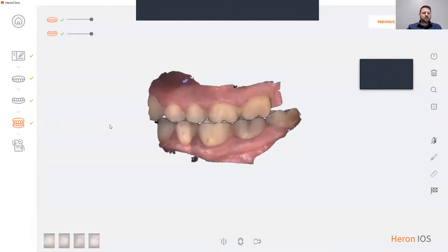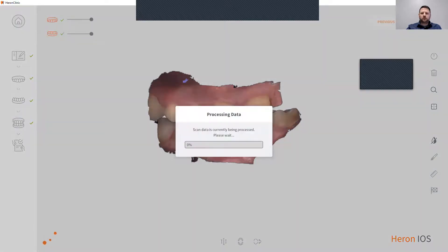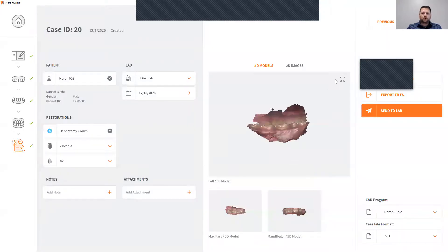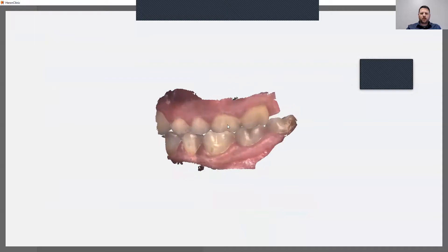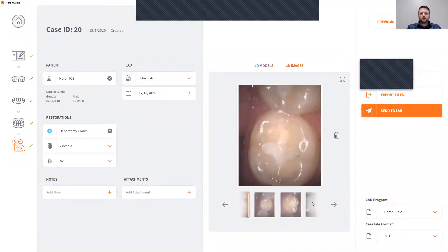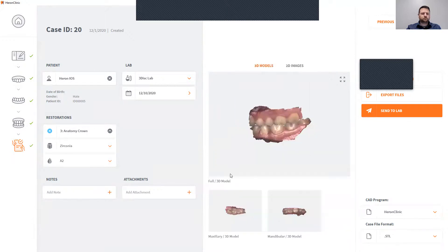To complete this process, you can click next and this will now process your files and take you to your prescription page. Once you're on your prescription page, you may view your files. You can also view the 2D images that you have taken.